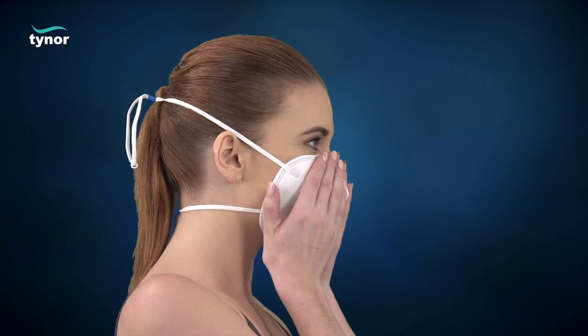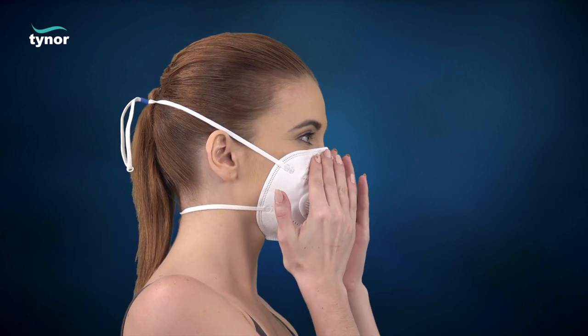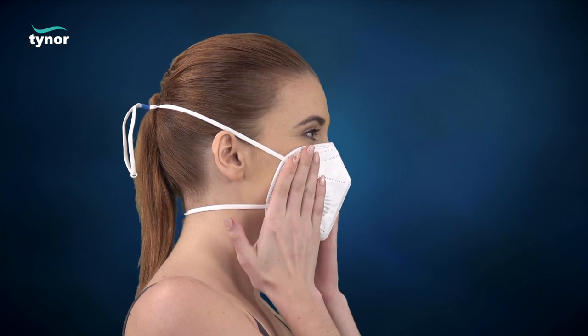Match the nose clip to the anatomy of your nose to achieve a good seal. To test the mask-to-face seal, perform a user seal check: place both hands completely over the mask and exhale sharply.